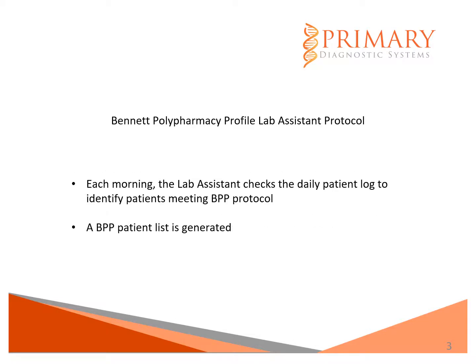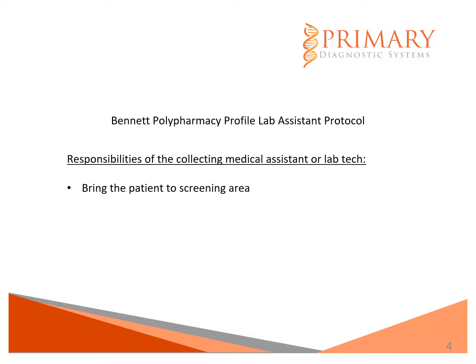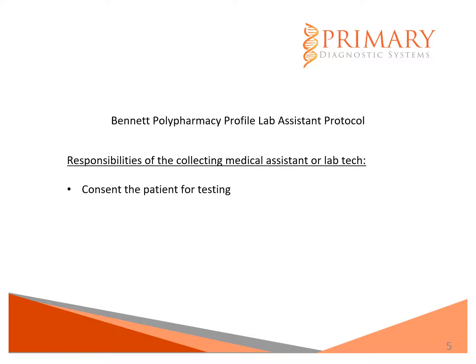In this process, each morning, the lab assistant checks the daily patient log to identify patients meeting BPP protocol. Then a BPP patient list is generated. The first responsibility of the collecting medical assistant or lab tech is to bring the patient to the screening area. The collecting medical assistant or lab tech also has the responsibility of consenting the patient for this testing.